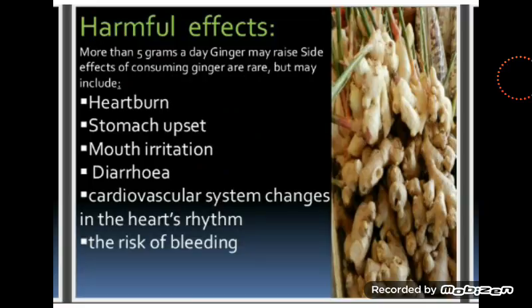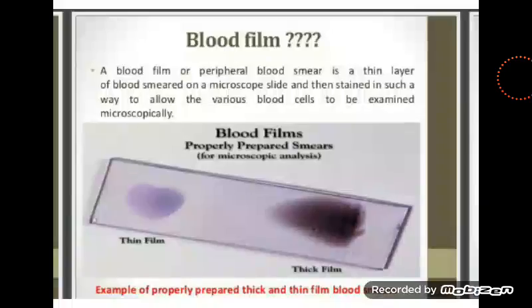Then the risk of bleeding. Please, the risk of bleeding here does not mean hemophilia. All right. Now the next thing here is blood smear. Please don't be confused when you're saying blood film. It means the same thing.